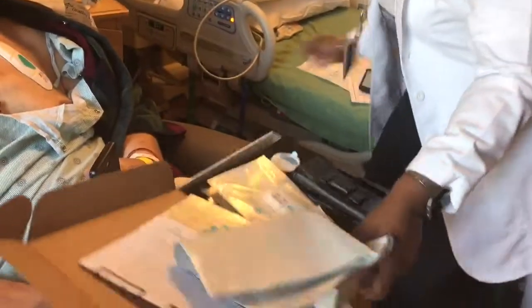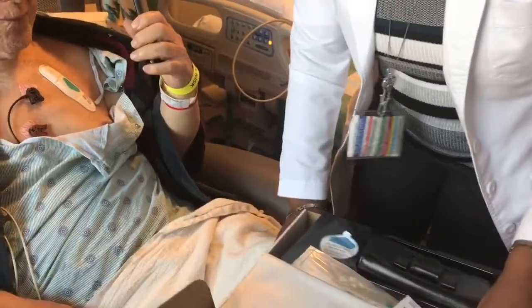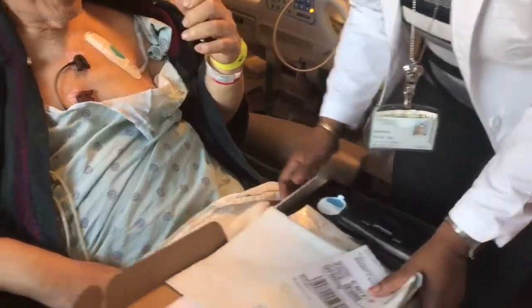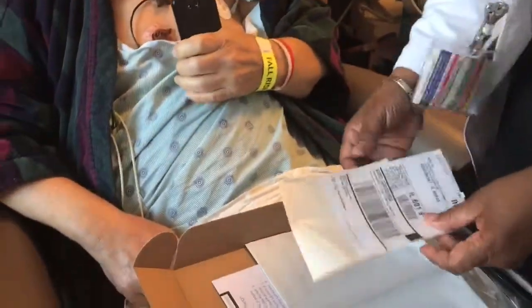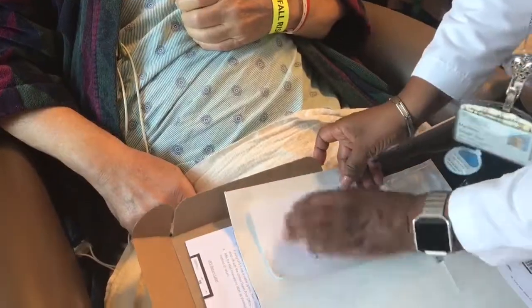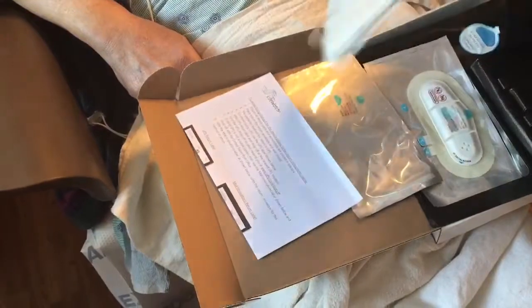So we were going to show you — you have a self-addressed mailer here. You can drop this off either at the post office or UPS, whichever one is more convenient. You're going to put the entire box and its contents inside the mailer.